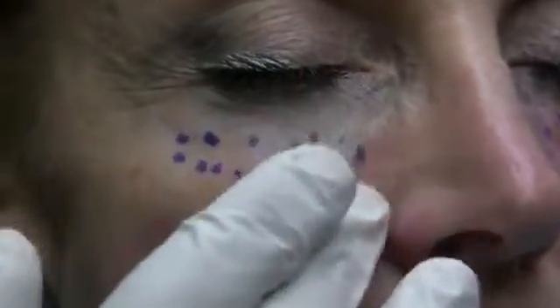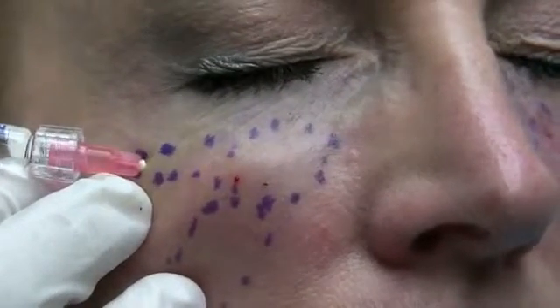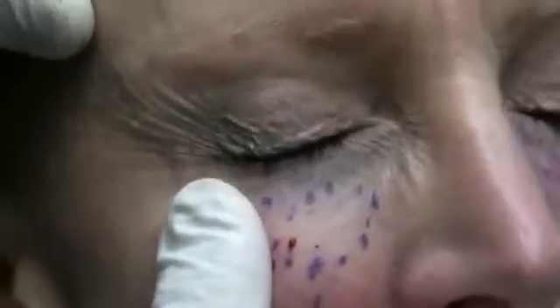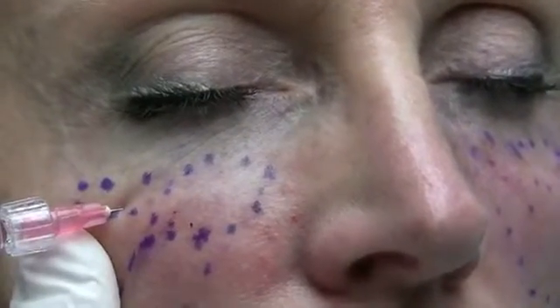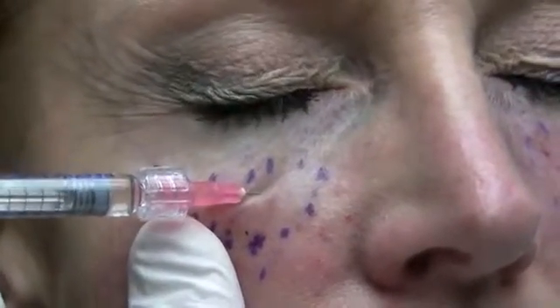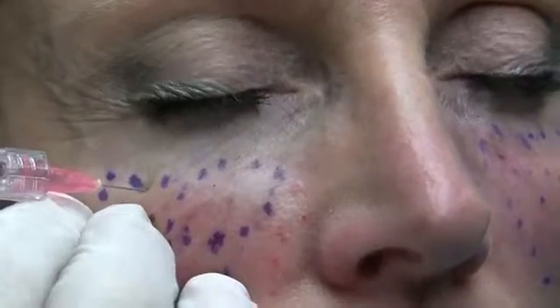So when people discuss layering of fillers, that's fine. But again, I think when we inject, we're always layering fillers if you're doing it correctly, because they do better in multiple tissue planes. So you can see here that my markings are really everything in terms of my augmentation. And this is an excellent patient, because even with the blocks and the infiltration, it's a little creepy to have somebody inject these areas. And we're almost finished here.